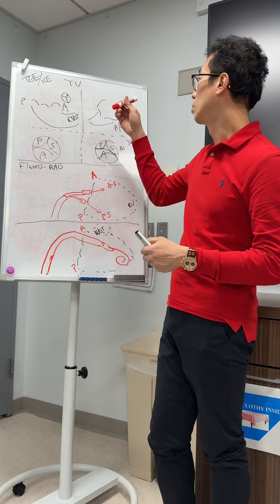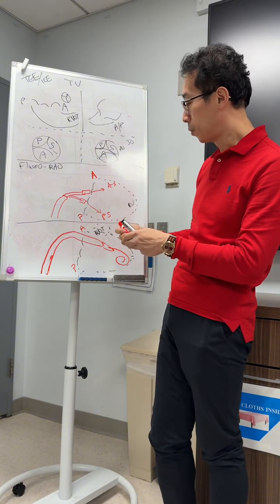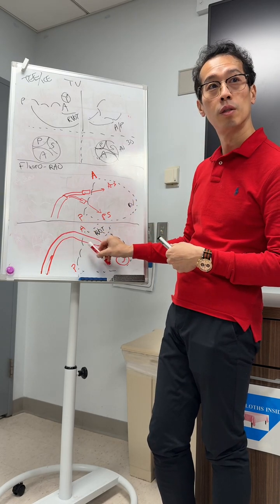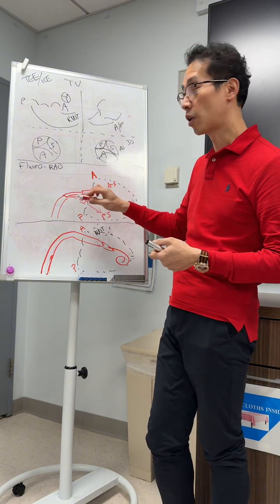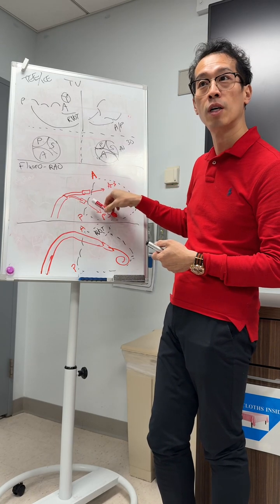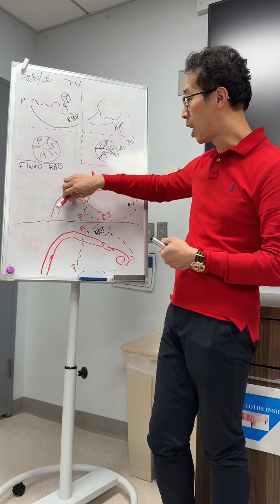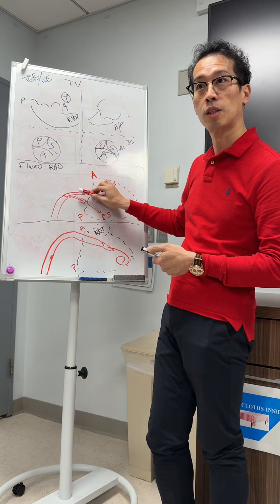Okay? So, for example, this is very, very important. Here, for TTVR, you use what's called primary flex, right? Primary flex is basically flexing this way. Okay? What would be the equivalent for TriClip, for example? F naught, right? So F naught will be going this way. Now you'll be very careful, when you do too much F, it's going to dive towards the free wall, the posterior part of the valve. Okay? So it's very important to stay perpendicular. So you can see now primary flex on the Evoque system is actually the equivalent of the flex of this.